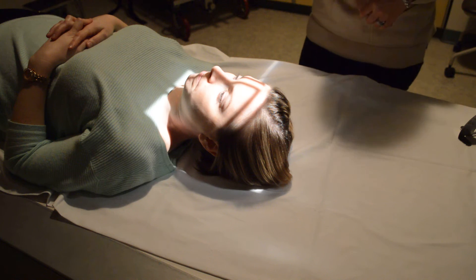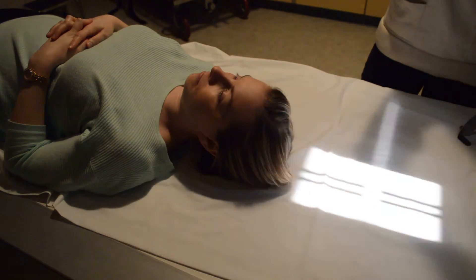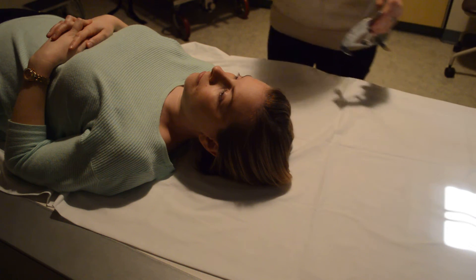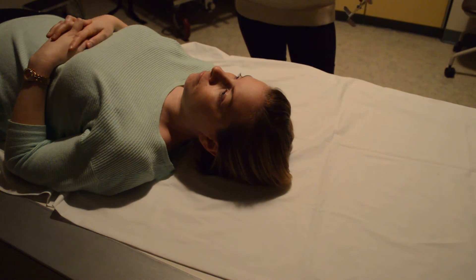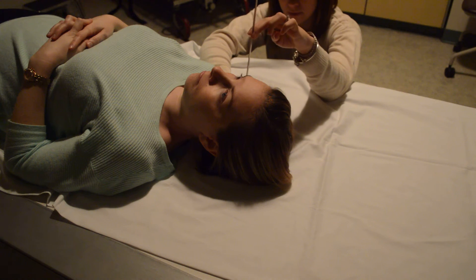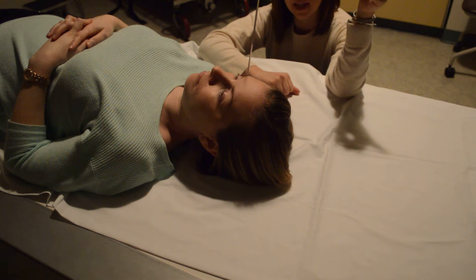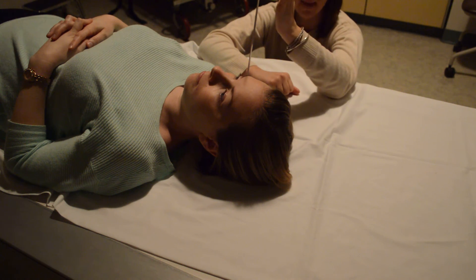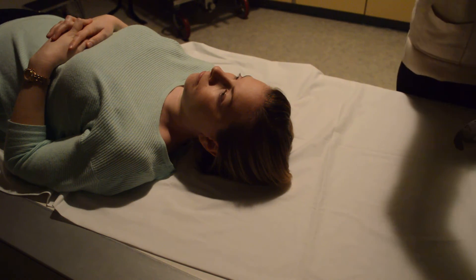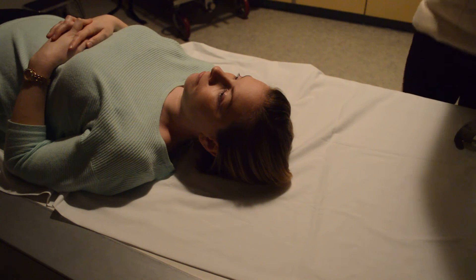Moving on, next we'll do an AP zero degree in the trauma. When we do a regular PA zero degree, we get the OML perpendicular so we can utilize a zero degree tube tilt. Again, I'll measure the OML — and again I'm at 10 degrees caudal. I want my CR to be parallel to that OML so it acts as a zero degree tube tilt. So I'll get my SID back up to 40 and utilize a 10 degree caudal tube tilt to match my OML.